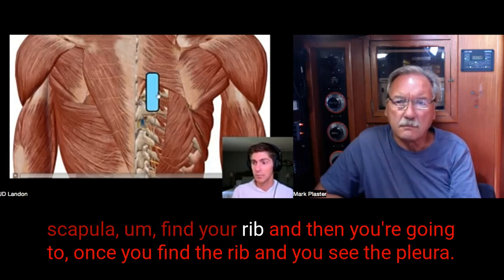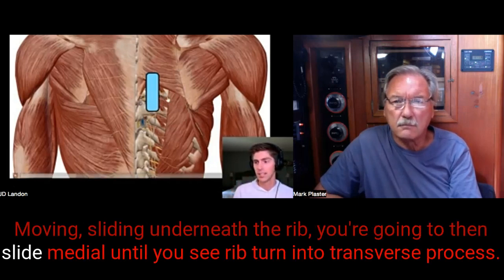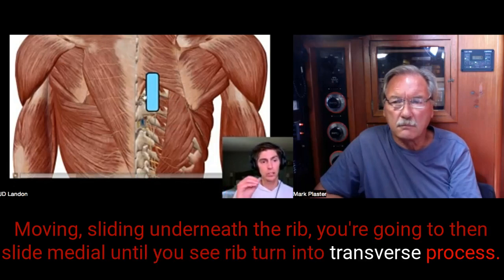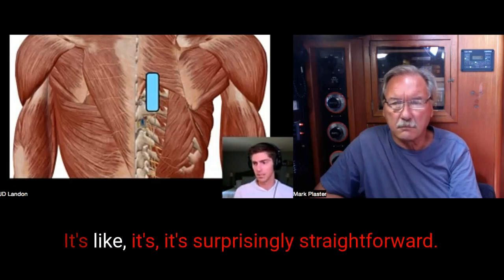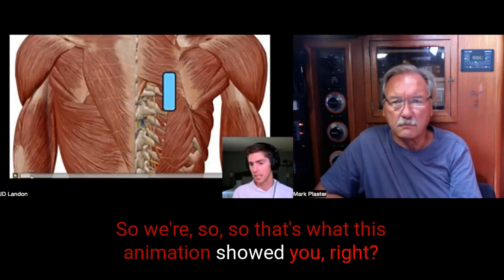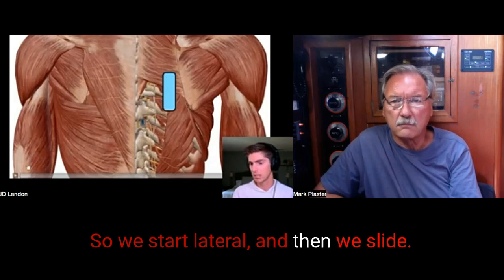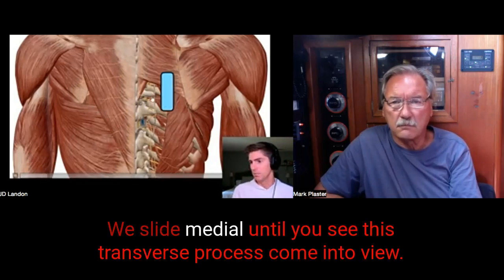Find your rib, and once you find the rib and see the pleura sliding underneath it, you're going to slide medial until you see the rib turn into transverse process, and it's going to be clear as day. I promise, it's surprisingly straightforward. So that's what this animation showed you. We start lateral, and then we slide medial until you see this transverse process come into view.